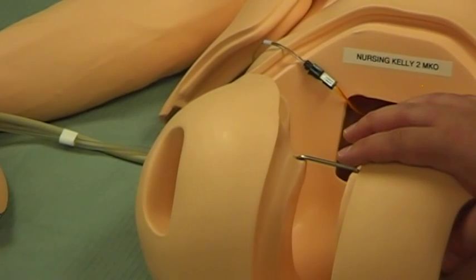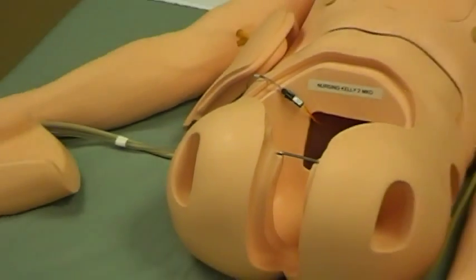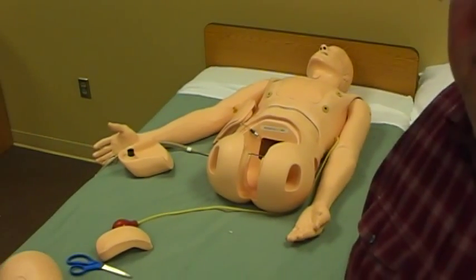This just keeps track of our inventory and where our assets are. So this has been identifying your serial number and then giving a unique identifier to your Nursing Kelly mannequin. Thank you.